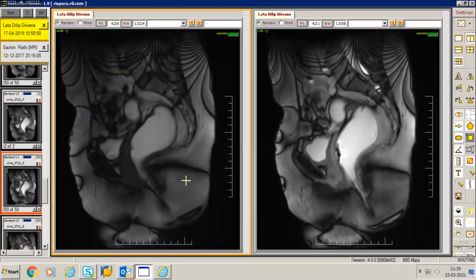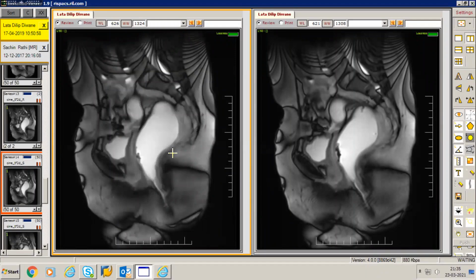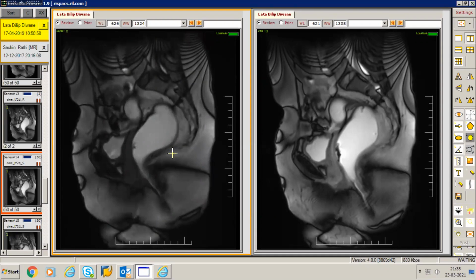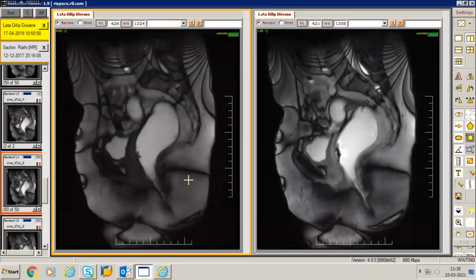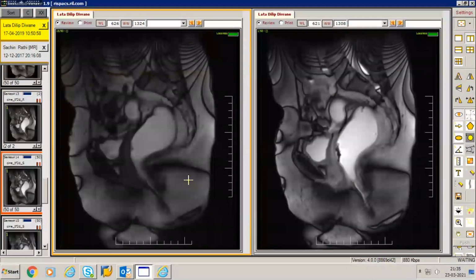Now that dysfunction is usually at the muscle level or the neural level. So again, Swaroop, if you could just run that through and show it to them. Yeah, so this is the cine loop of the patient when he is trying to squeeze. This is at rest. Now you start moving it ahead, you'll see it beautifully. You see that the movement is not only this way, this is anterior, but it goes upwards, towards the superior pubic arch. So that movement needs to come up. This elevation and anterior movement is what you see with squeeze, and this is dominated by the puborectalis. Therefore, these rectal ampullary changes are very characteristically seen.